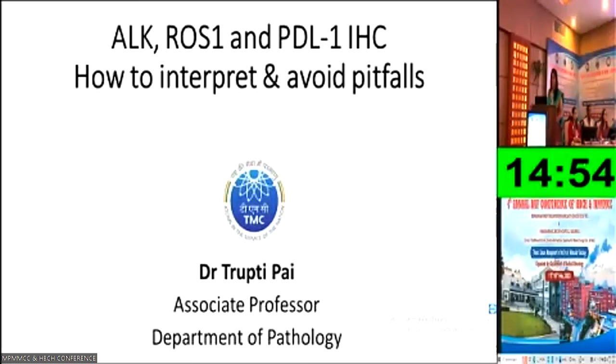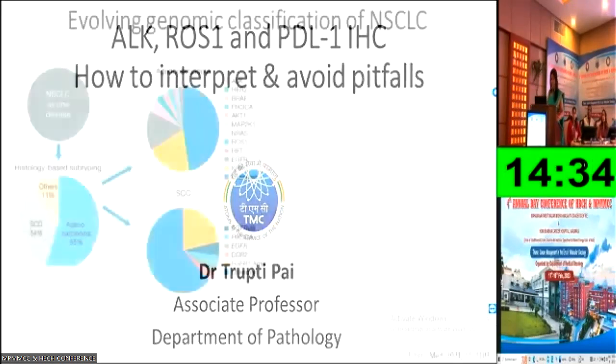So since morning, we are hearing a lot of cfDNA, NGS, panel talks on molecular. So this is also molecular. I will be talking on ALK, ROS and PD-L1 IHC, but it will be mainly a pathology based talk.